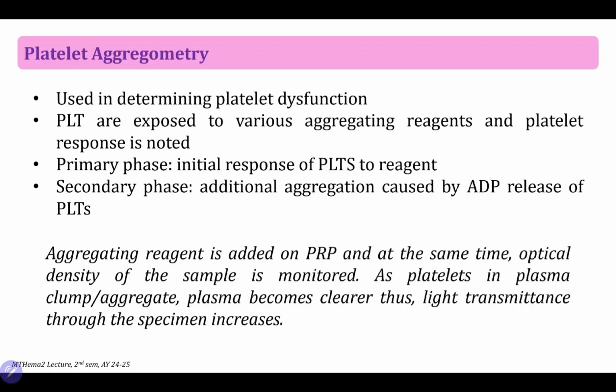Okay, so in platelet aggregometry, guys, this is used in determining your platelet dysfunction because, again, one of the functions of your platelets is to aggregate with other platelets. In this test, your platelets are exposed to various aggregating reagents, which are also known as your agonists, and your platelet response is noted.